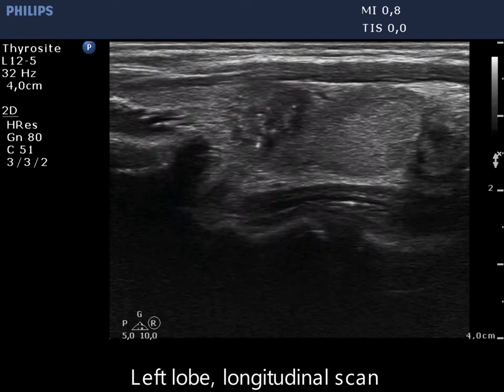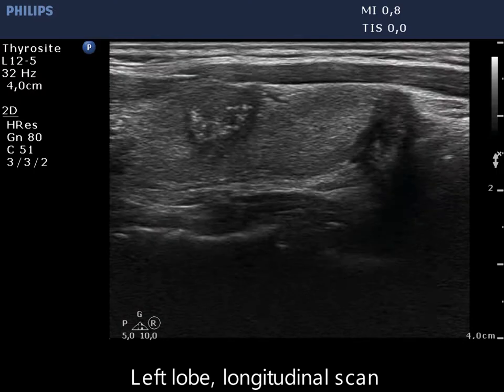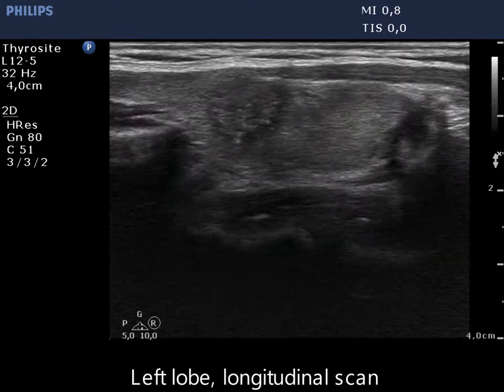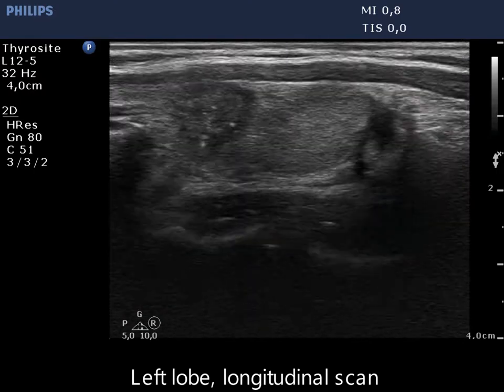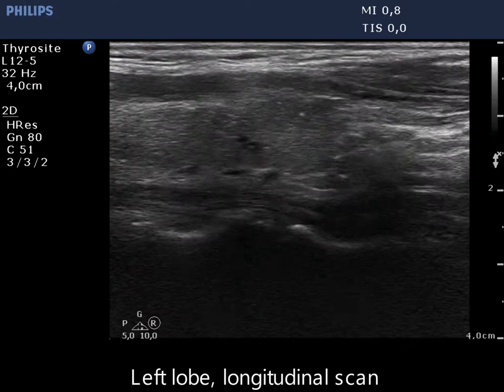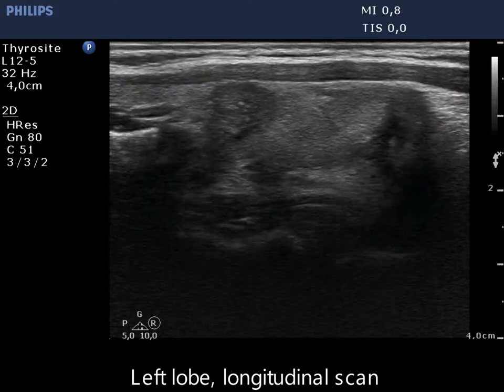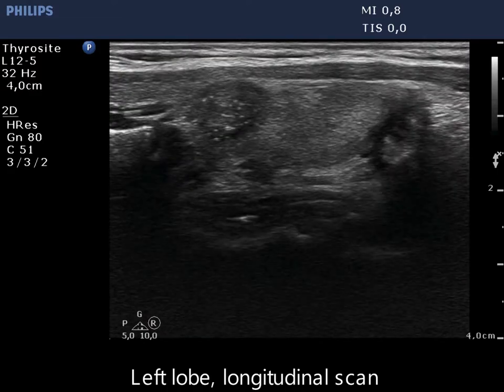Longitudinal scan reveals that the capsule of the thyroid is discontinuous at the upper lesion, which presents less than 25% tumor perimeter abutment with the thyroid capsule. This nodule has lobulated margins.